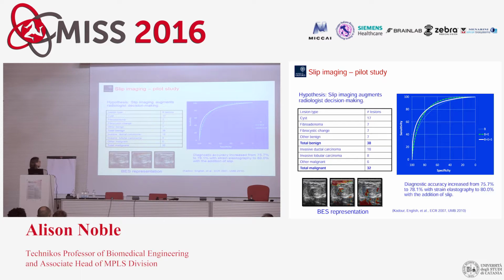It allows you to pick out the fibrous structure as well, but unfortunately some cancers also do slip around, which is why you can't introduce it directly into clinical practice. But it's an interesting observation from the clinic, and an example of translating through to using new image-based information to make decisions.